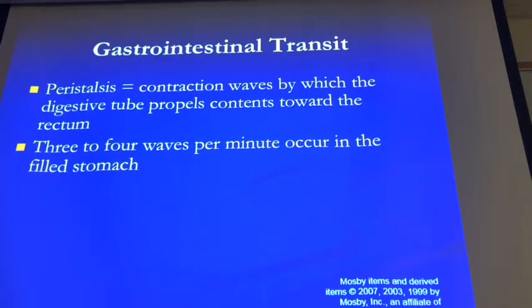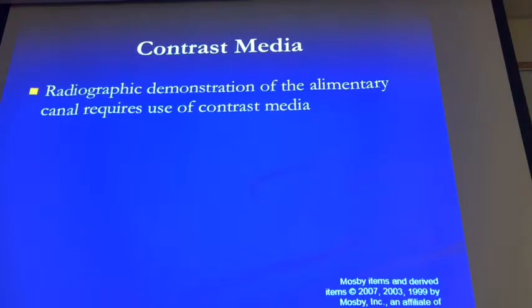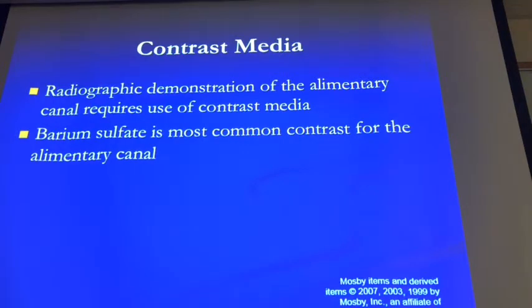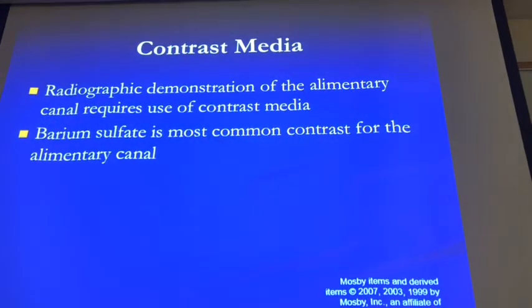Ready? Got it? Okay. All right, so contrast media. Radiographic demonstration of the alimentary canal requires use of contrast media. I told you that before. Barium sulfate is the most common contrast for the digestive system. It's not the only one, but it's the most common.